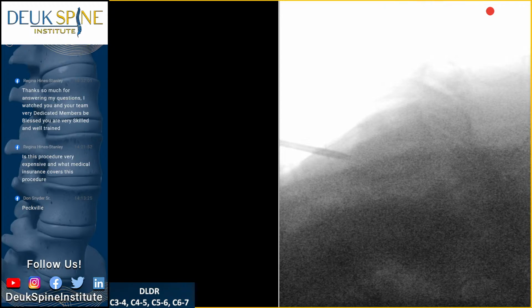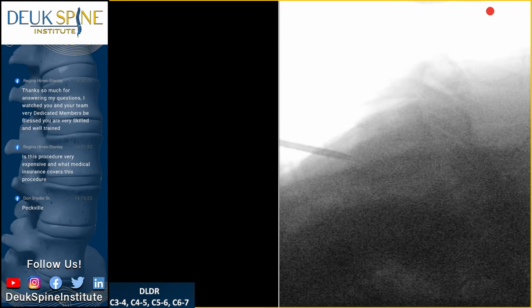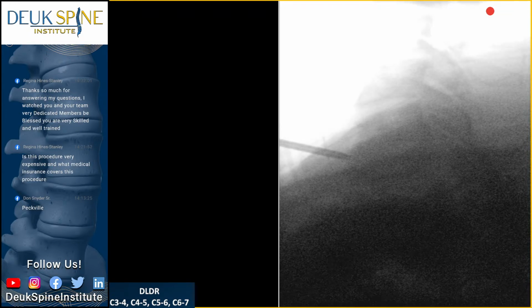Can you show me that disc a little better? I think I'm on it. What do you guys think? It's too, I need it less exposed maybe or something. I don't know. Yeah. Give me an AP. Give me the mallet.